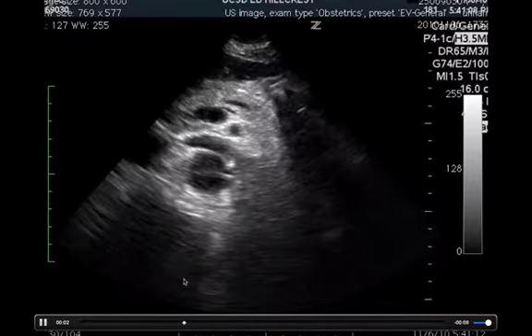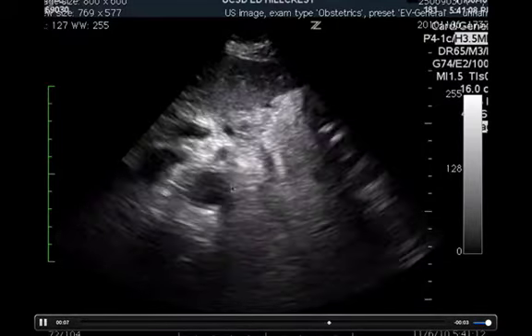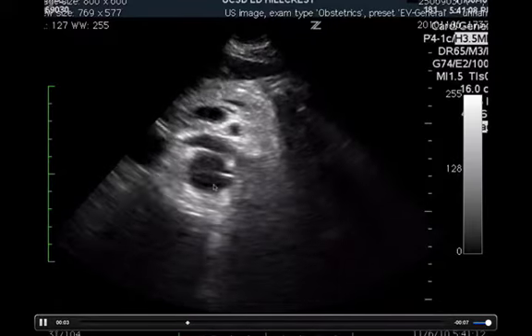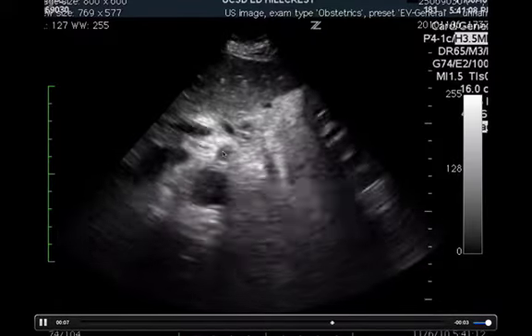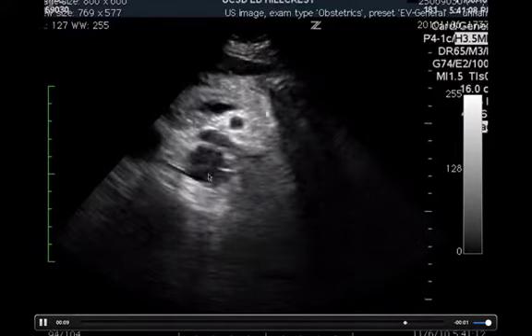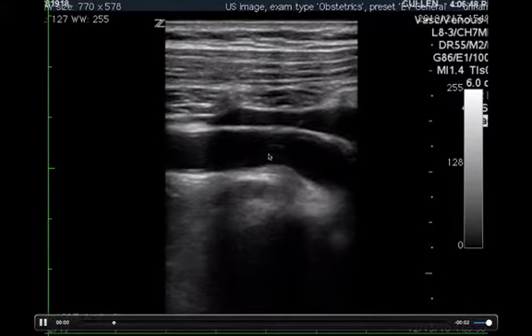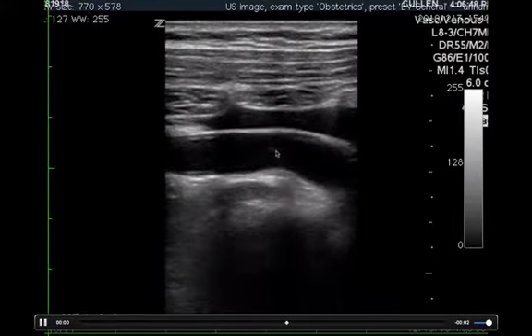So I got out my trusty ultrasound, and this is what I saw. It looked to me like a pretty clear dissection in the aorta, definitely at the level of the SMA here. This is a nice example of the left renal vein going in between SMA and aorta as well. This is again another example of how subtle dissections may be.